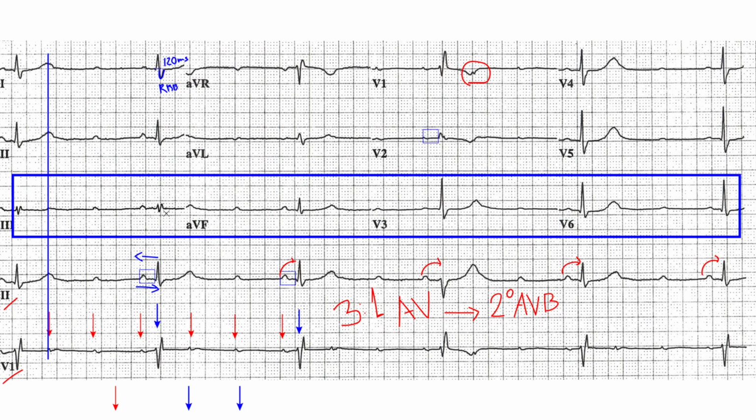With blocks, oftentimes, or actually in the ECG world in general, there's so much focus on hieroglyphics, right? So somebody tells you, memorize this right here. This is what Mobitz-II looks like. This is what second degree AV block, type 2, also known as Mobitz-II, looks like. So somebody will tell you, okay, memorize this.